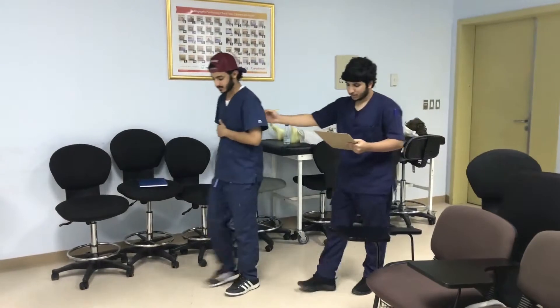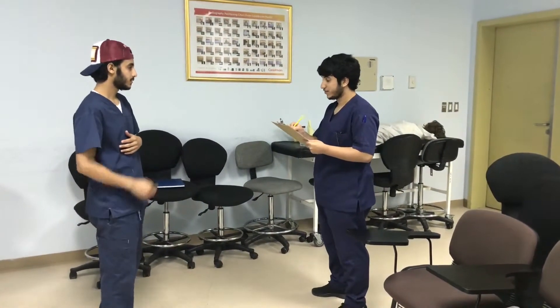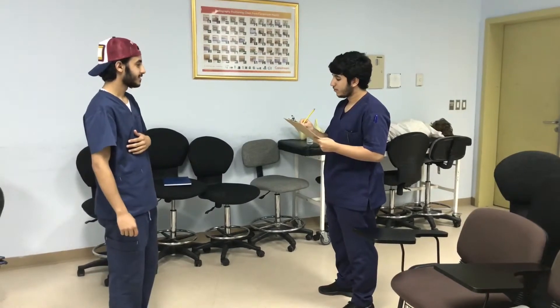It is an essential thing for the specialist to read the request to make sure that it matches the condition of the patient standing in front of him.